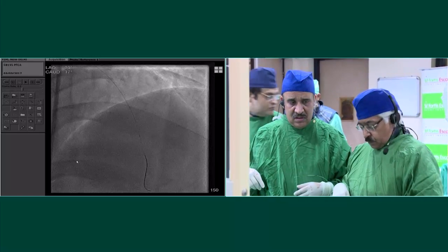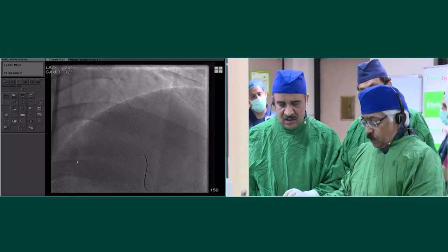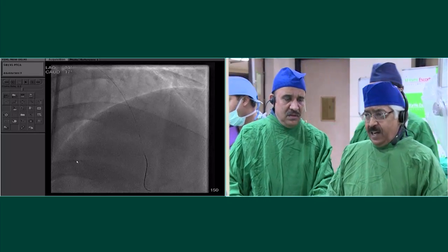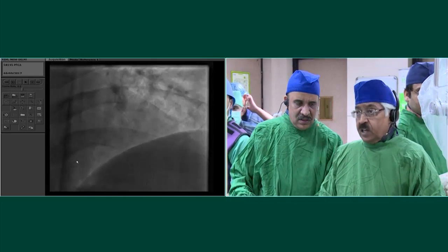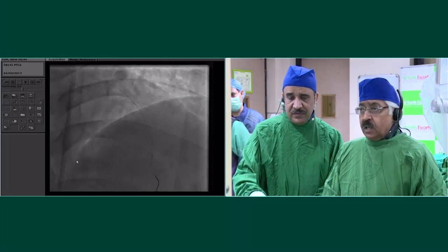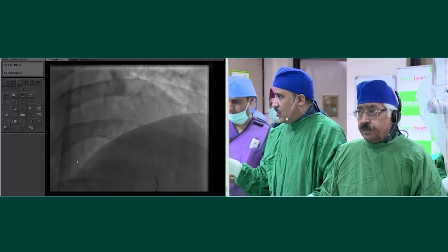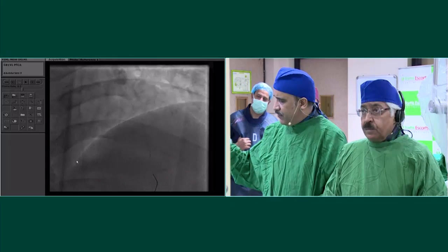I'm actually doing the cutting balloon, then followed by OCT. Because I'm going to do cutting balloon anyway, but the OCT would be to size the vessel appropriately and know exactly what to do. Would it be a metallic stent from the ostia, or would it be absorbable from the ostia? 3.5.